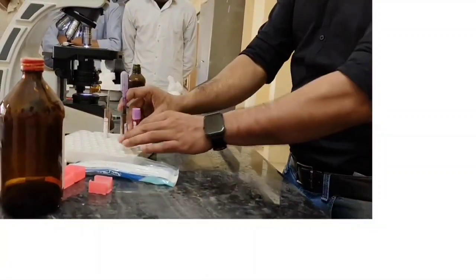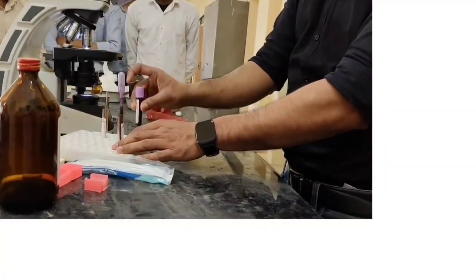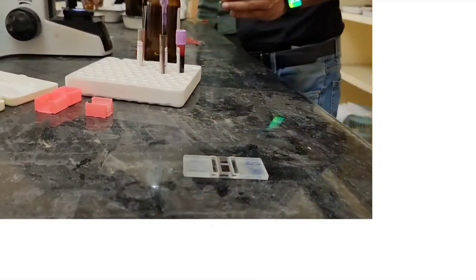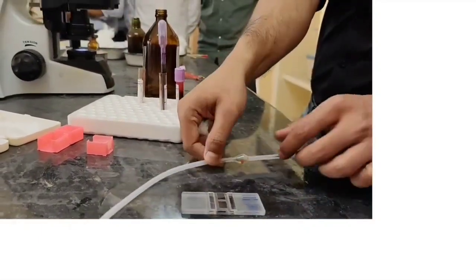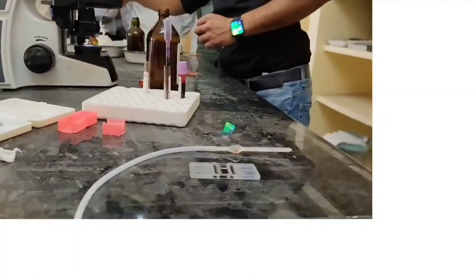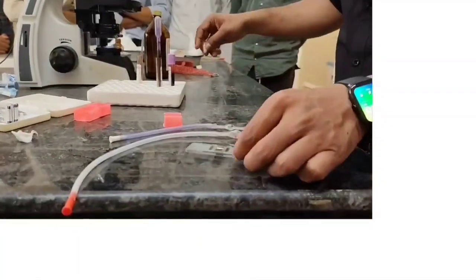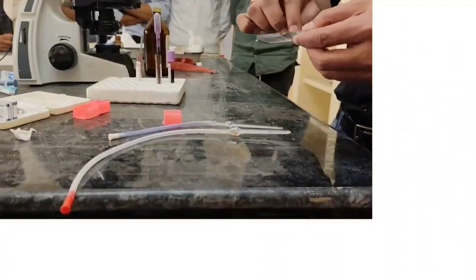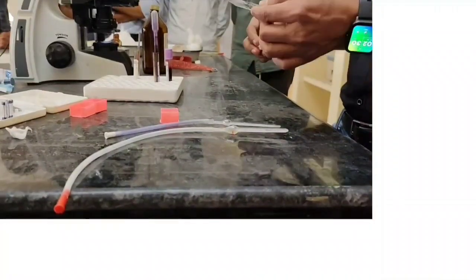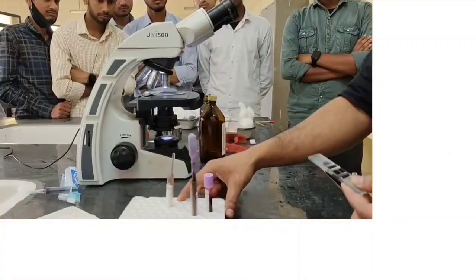Now we are ready with the blood to do the test proper. I am mixing it so blood should not get coagulated. We are going to start the procedure of RBC counting, total RBC count. So I am going to take the RBC pipette. This RBC pipette must be clean and dry. Then the improved Neubauer's slide, and this slide and all the instruments should be very clean and dry. So make sure you wash them with soap and water. Neubauer's slide and pipette should be completely dry and clean before use.